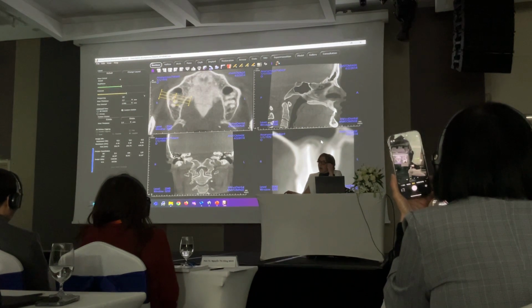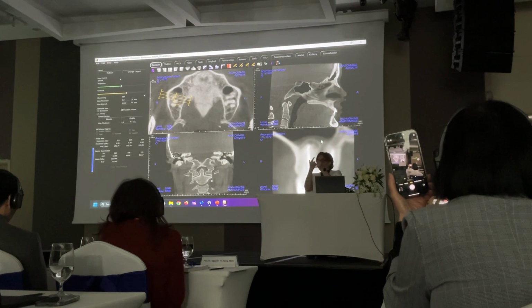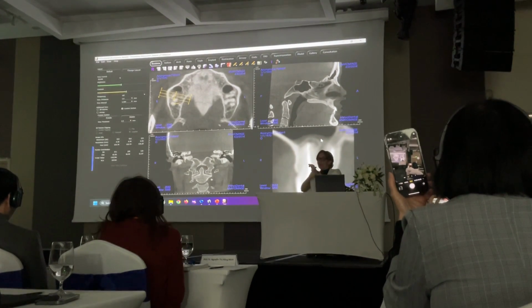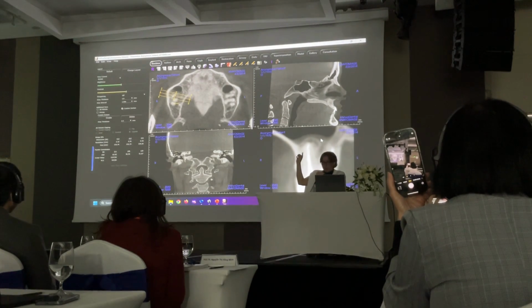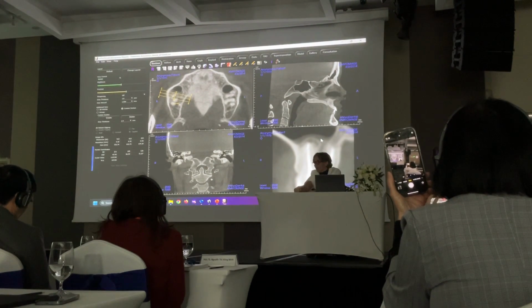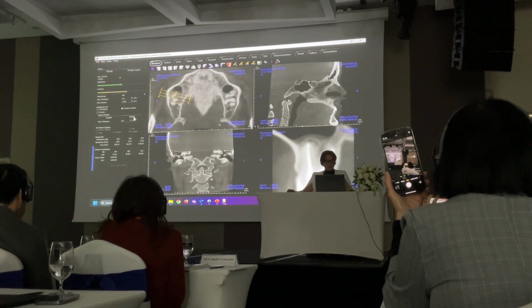And they will not diagnose this patient as having a dental problem. And they'll do surgery for the patient, for the nose and the sinuses. They will give them medication, and the sinusitis doesn't go away because they don't solve the problem, which is the infected tooth. Okay? You are the key to the correct diagnosis because of your knowledge of dental infection. Okay? And cone beam CT helps you make that diagnosis and helps you prevent unnecessary treatment in a patient.